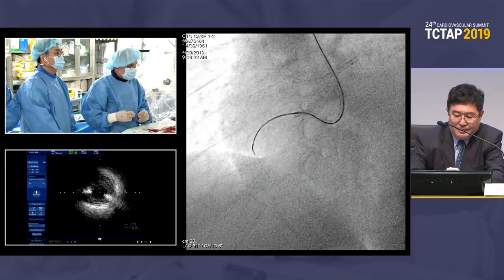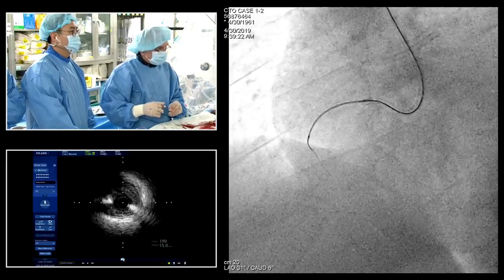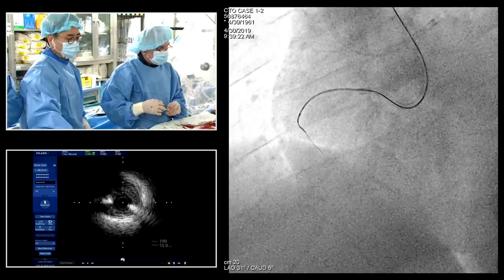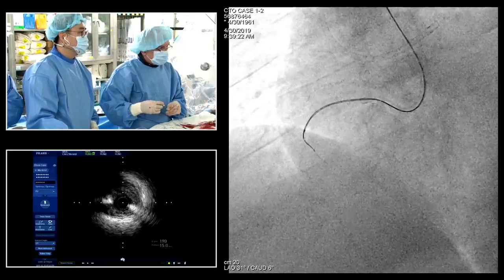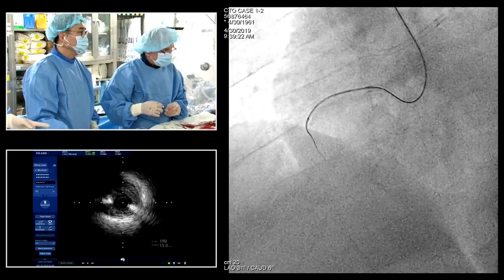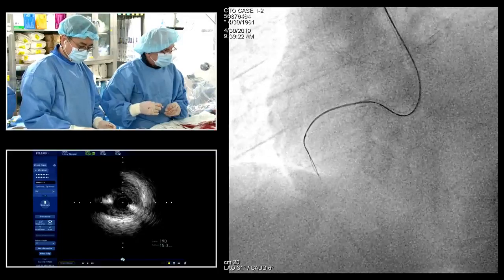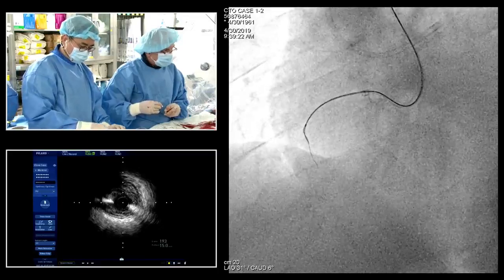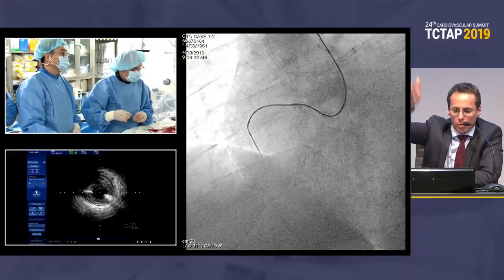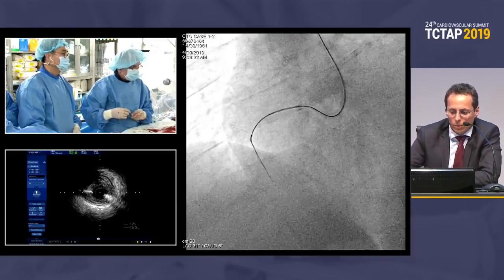Okay. So here we have the Sasuke, and I have Gaia 2. And I know that, of course, I have to turn a little bit down and left. Let's see, it's overlapping the course of the previous wire. At one point, I need to go down and left. So the wire doesn't do that. The thing is that in RAO, you could see a wire deviation towards the myocardium side. So probably in RAO, it's easier to puncture straight downwards. This is kind of too far out.